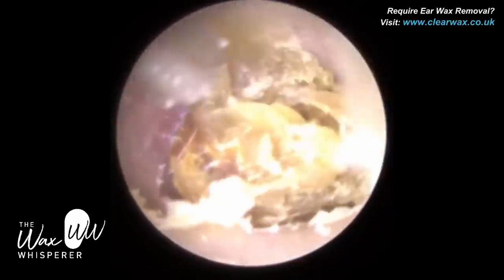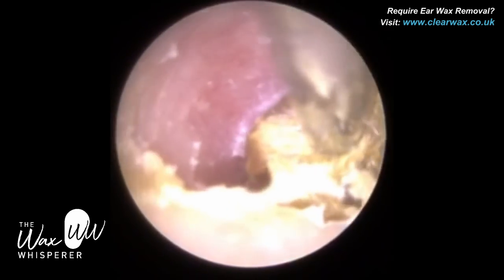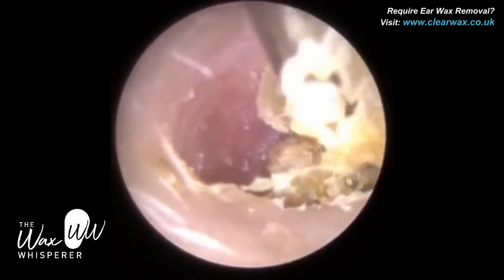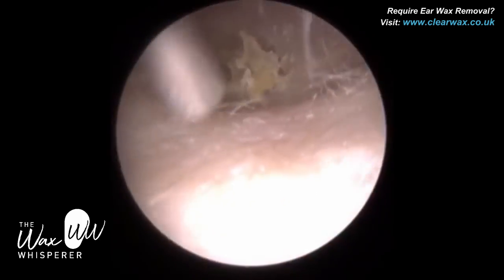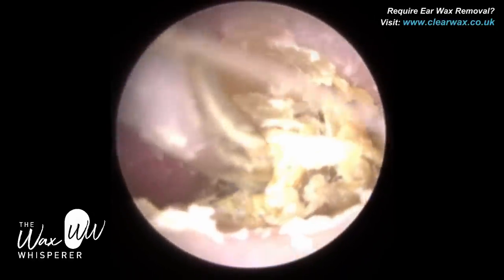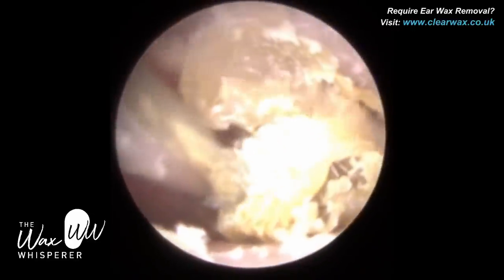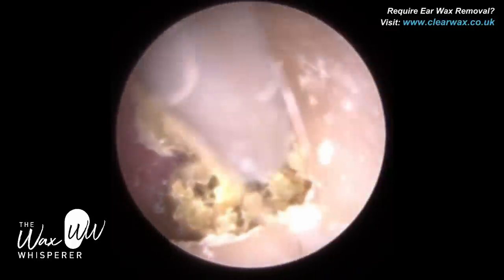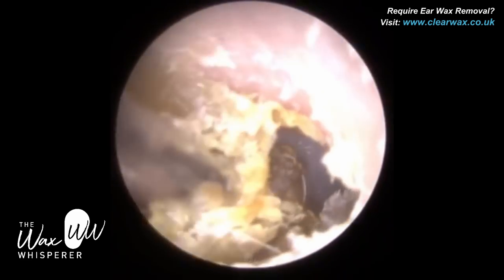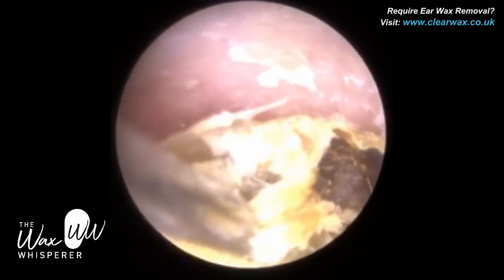I can see at the top I'm just peeling this off the eardrum. Related to the first ear, this patient's isthmus has a quite pronounced narrowing about half a centimeter away from the eardrum, and that's where the skin is collecting — migrating to this point but getting trapped, not migrating any further. If this were left untreated, the patient would develop a very serious keratosis obturans, which is a buildup of dead skin plugs, typically deep and medial in the ear canal.